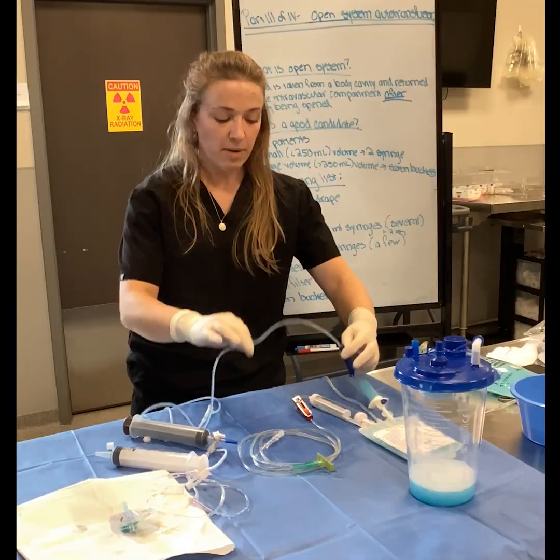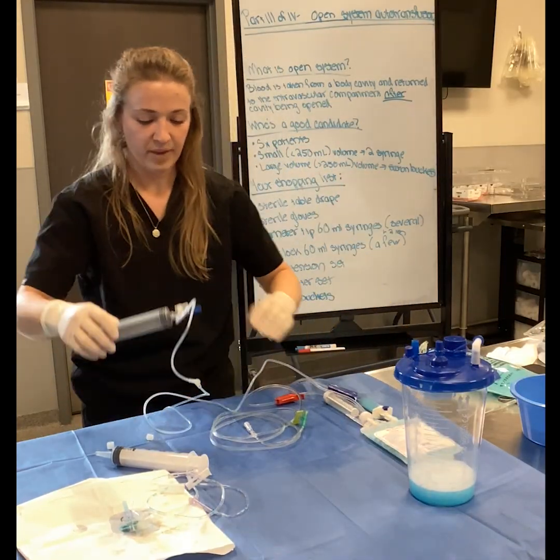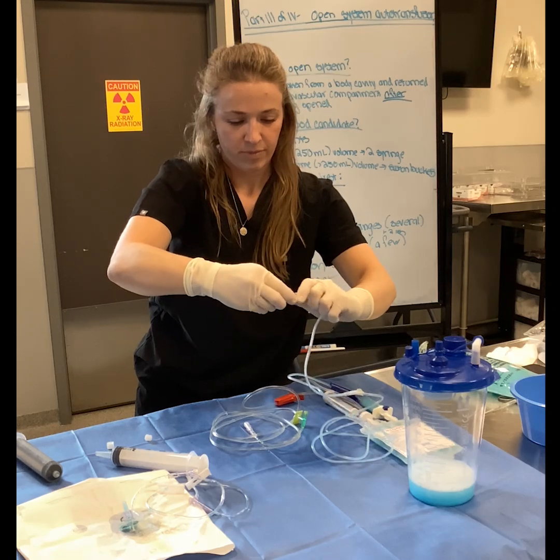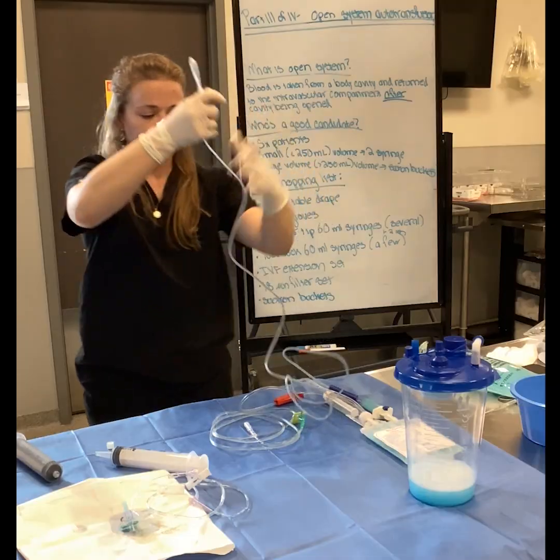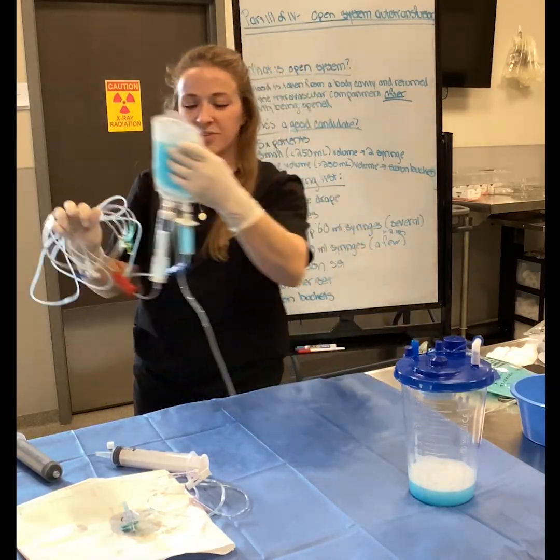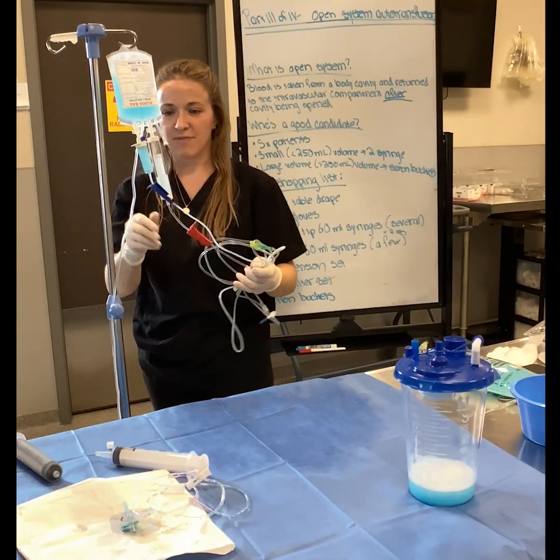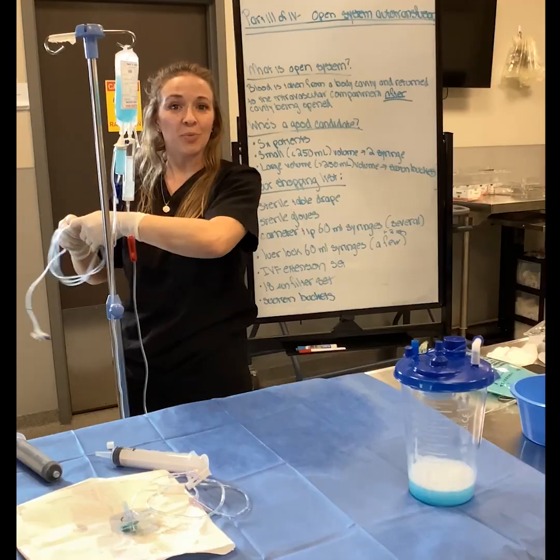So let's say I'm done with that. I'm just gonna close up my bag here. That way it's not gonna drip out that side. I'm just going to disconnect some of my equipment here. So you'll probably notice that on this bag I have 2 administration sets here. I have both a blood set and then I have an IV fluid set. So the IV fluid set is of course the side that I put the blood into the bag.